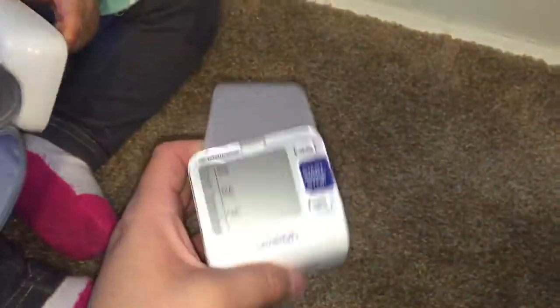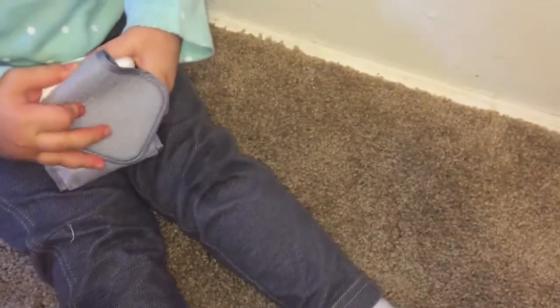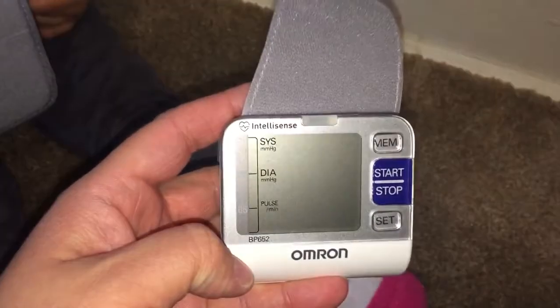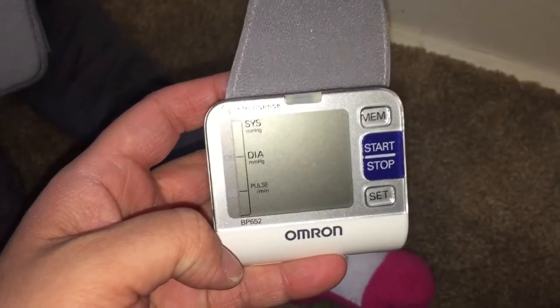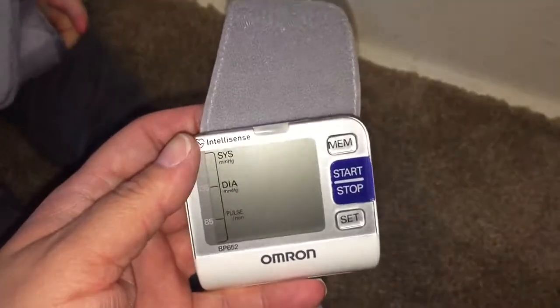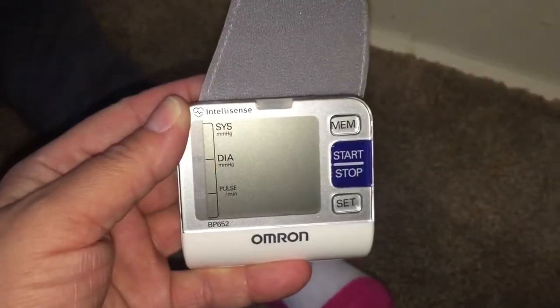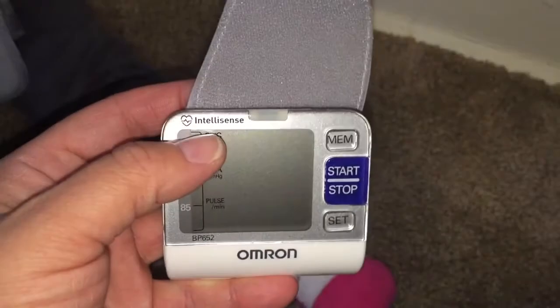I'm assuming Omron makes RelyOn. I have high blood pressure and I'm a single mom to a wonderful little girl who's assisting me in this video, so having an accurate monitor is very important. I got the Omron because it was the number one blood pressure monitor on Amazon and a couple of my doctor's offices use this exact wrist cuff monitor.